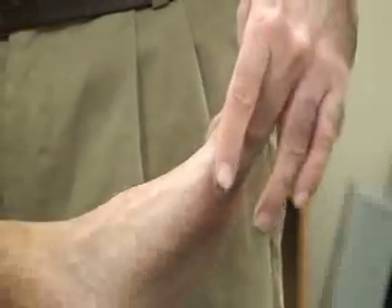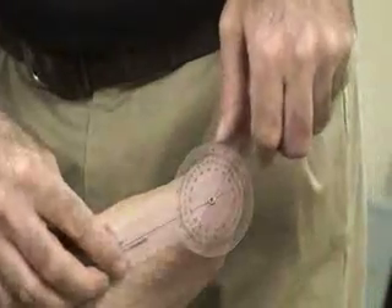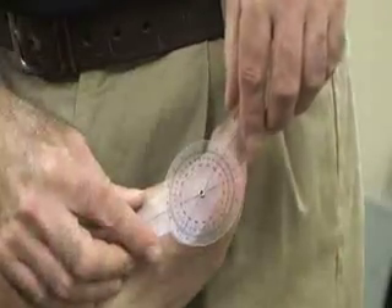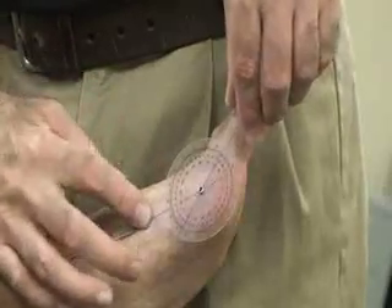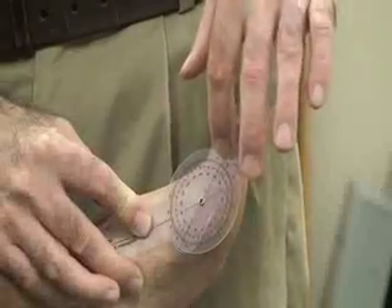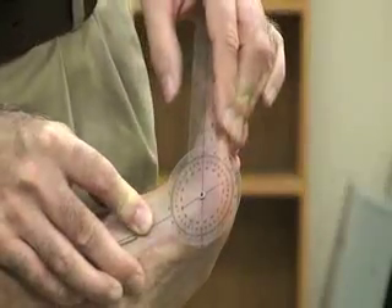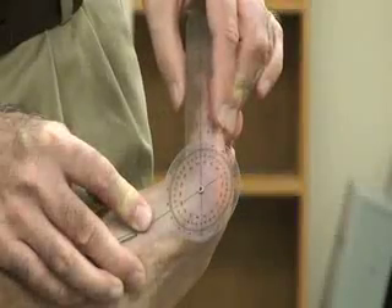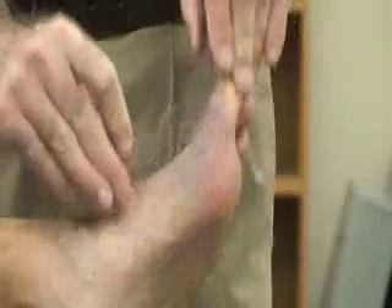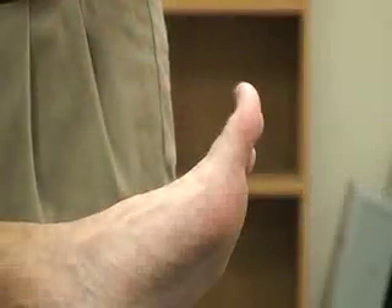We're also going to do extension of the same joint, the metatarsal phalangeal joint. Again, we'll use the plastic goniometer. The fulcrum is at the metatarsal phalangeal joint. The stationary arm is along the metatarsal bone, and the moving arm is going to be in line with the proximal phalanx of that joint. Then we're going to extend it, keeping it aligned and getting our measurements. For the first digit it's going to be 70 degrees; for digits 2 through 5, it's going to be 40 degrees.